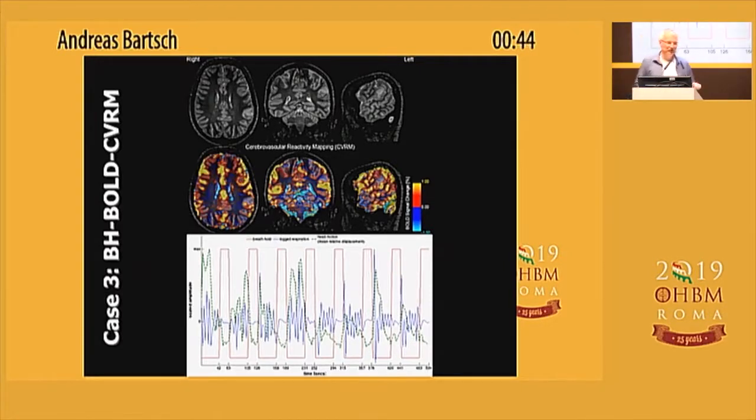So you have less head motion during the breath hold, which of course, when you do motion correction or include motion parameters as a confound, now gives you a very strong correlation with the paradigm, but whatever, okay. And the maps actually show that the cerebrovascular response to breath hold maneuvers in the tumor is reduced, okay? So no perfusion abnormality, but reduced. And then some people would say, oh, is mapping really helpful?